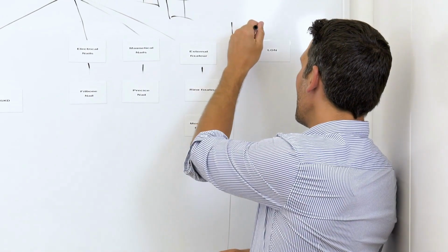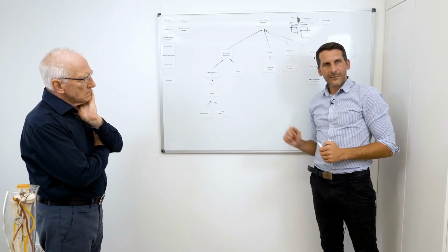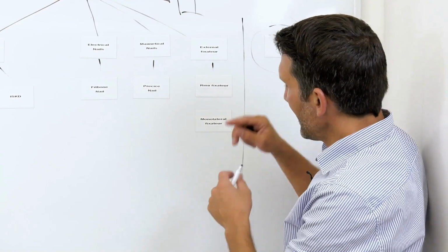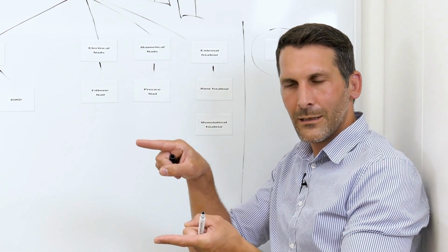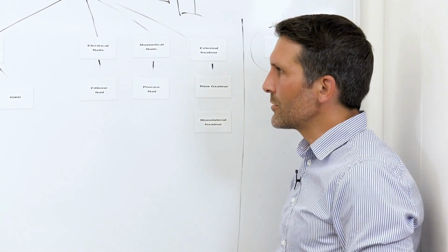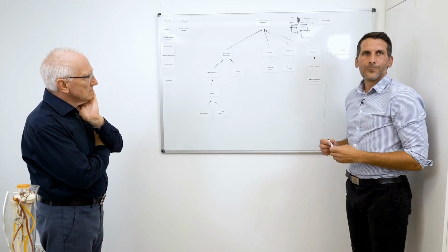Everything that describes LON here. LON is not a nail that has an integrated advancement mechanism. It's not. Rather, it's simply a completely normal solid nail. And this solid nail stabilizes the bone. Then, in addition, an external fixator is also introduced to carry out the distraction mechanism. That's the difference between internal fixators, external fixators, and the hybrid, so to speak, the LON system.